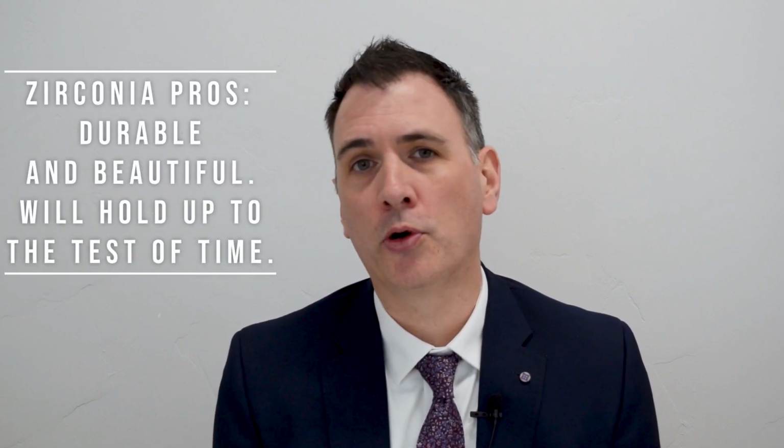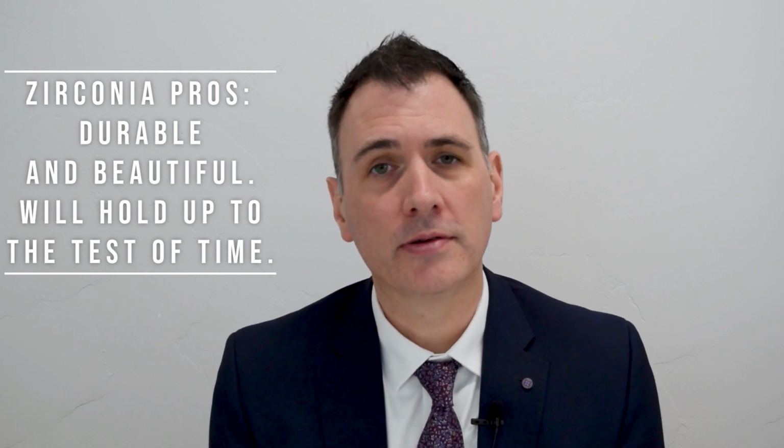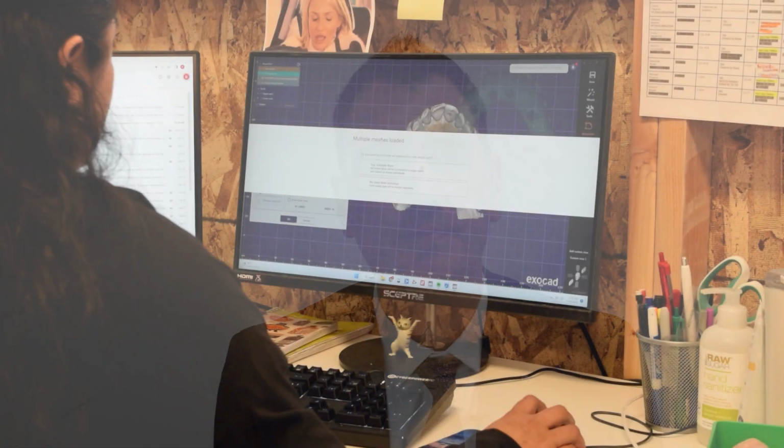And because it's so strong, it lasts an extremely long amount of time. It really is the gold standard when you're talking about permanent teeth. In fact, it's the same material that we use to make crowns. For somebody that might have a posterior tooth that needs to be really strong to support bite force, we use that same material for natural teeth as well. So it has a lot of applications and is a really, really good option.